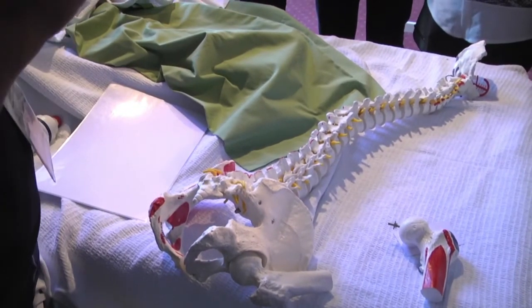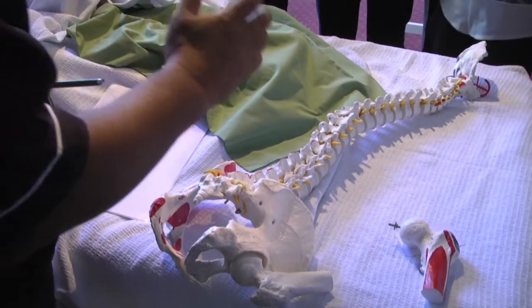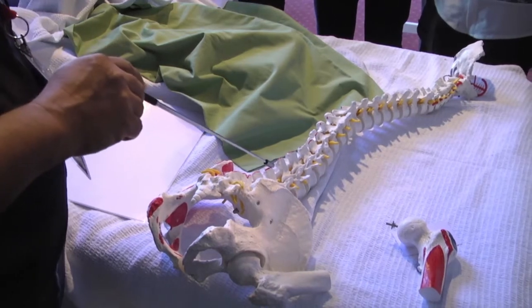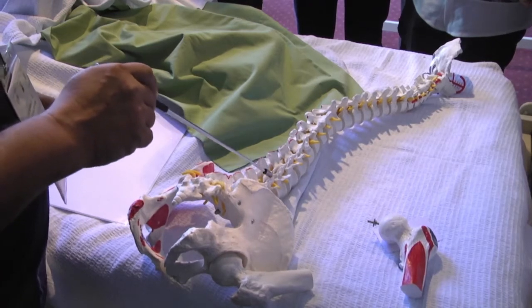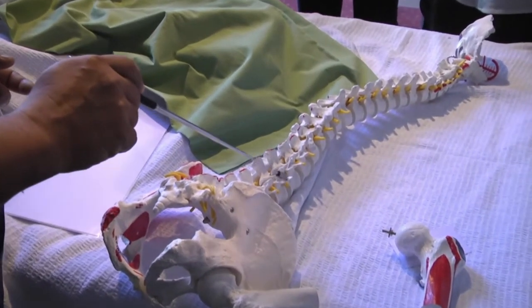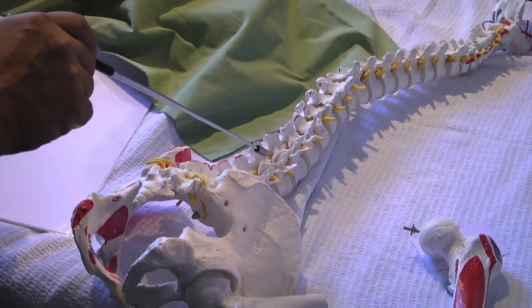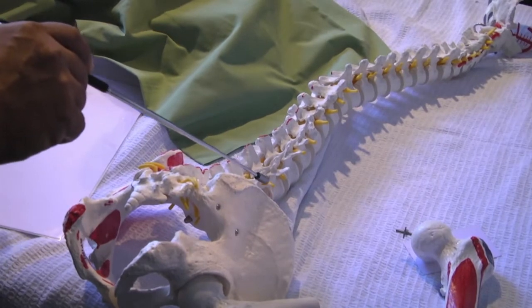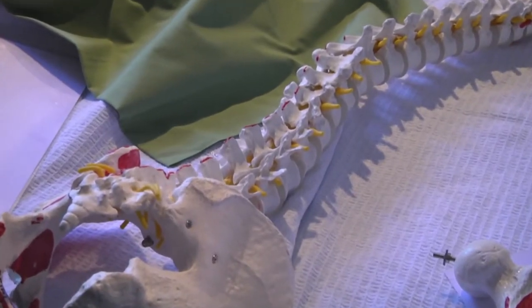The first fundamental basis of spine imaging is to recognize the osseous elements. There are many osseous elements, as you know. This is the spinous process, this is the lamina, this is the articular process. There's a superior and an inferior, and they articulate to form the facet joint. Laterally you have the transverse process. So in the midline you have a spinous process, the lamina, and further down you see the articular processes, facet and the transverse process. These are the basic osseous elements that you see here.